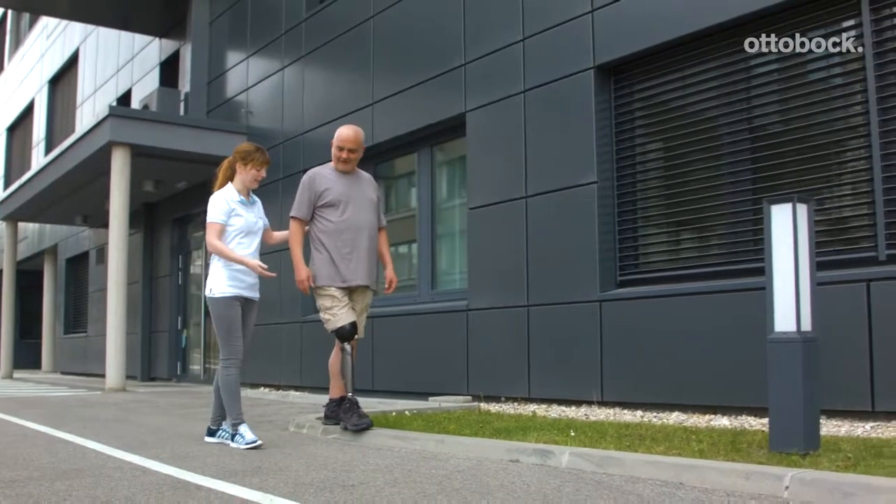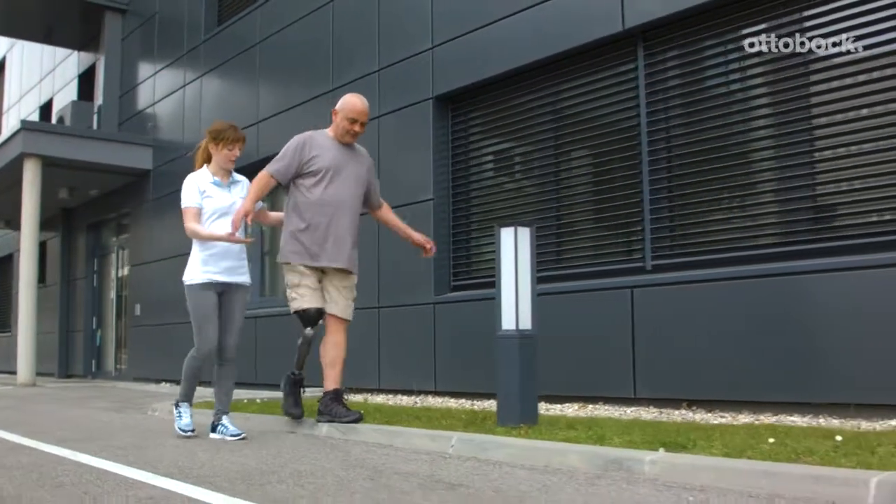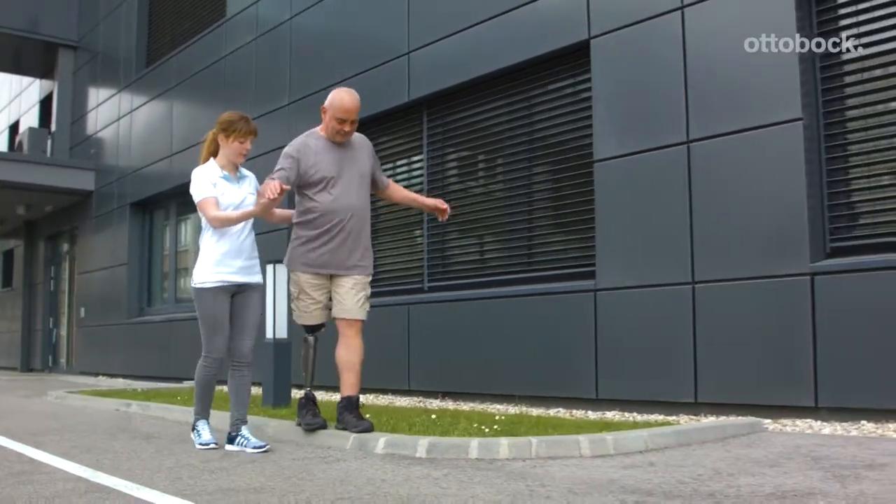Curbs and other obstacles are good opportunities to include balance exercises in the outdoor training. That increases self-confidence and coordination skills.